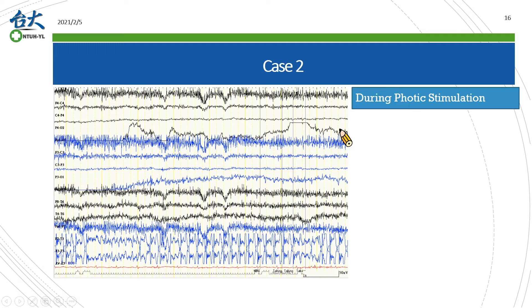Along with increased EMG artifacts diffusely, there were also some marks at the end of this epoch, suggesting our technician noticed this artifact and tried to calm down the patient.